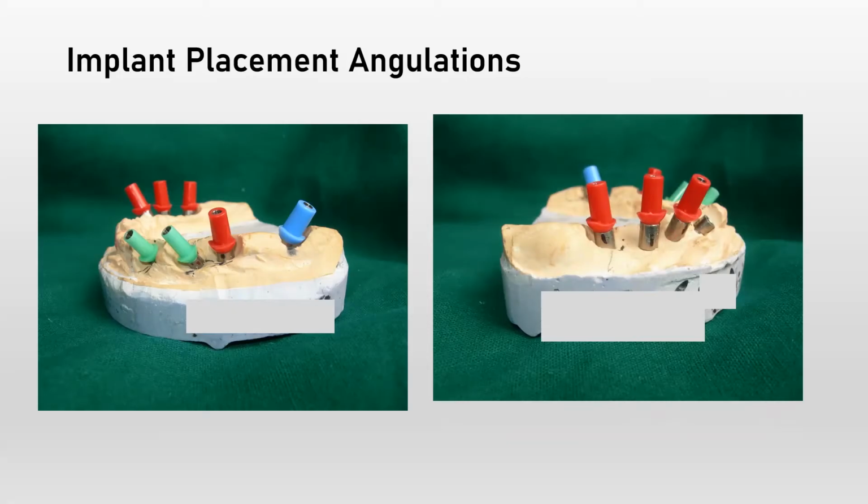Otherwise, looking at the positions of the implants as of now, the lab and everyone has to sit and struggle with the design. Of course, with CAD CAM technology, it's much easier now. This is a picture from earlier days, but now the fabrication process is much simpler and easier compared to earlier because of digital technology. So moving on, I would like to start the demo here. I would move to the live software now. I'll share my screen.